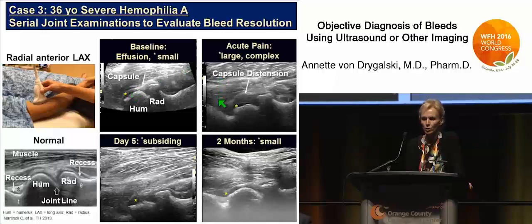But then upon presentation, you can see the distension of the capsule here over the anterior joint space. It's filled with complex bloody material. And then 5 days later, his pain was gone on day 2 after 2 infusions with factor VIII. But 5 days later, despite the fact that pain is gone, this bleed is still lingering. It's not resolved yet. We imaged him 2 months later, demonstrating that we really don't understand how long blood remains in the joint and why it is that factor seems to ablate pains after 1 or 2 days. Pain is gone, but bleed remains.